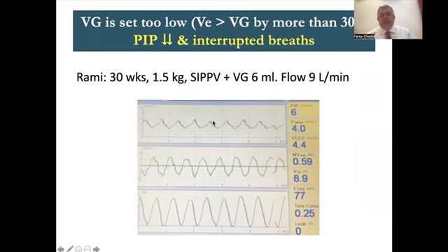But what happened, I looked at his pressure graph, it should be rectangular, it's triangular. How come? Time is very short here, and I'm not giving a talk on graphics, so I will leave it. But the point is that the patient is breathing at 77 per minute. How come a patient who's ready to extubate is having intercostal and subcostal recession and a rate of 77? Why didn't he take all his PIP? The point is that the patient is 1.5 kg, and the physician ordered 4 ml/kg, which is 6 ml.